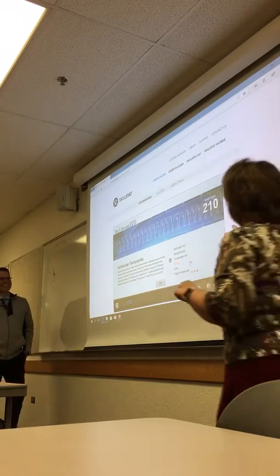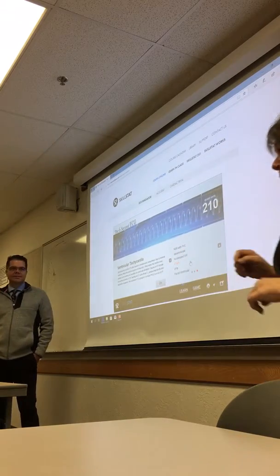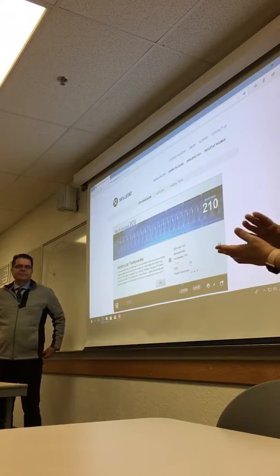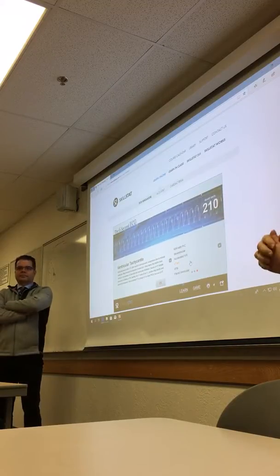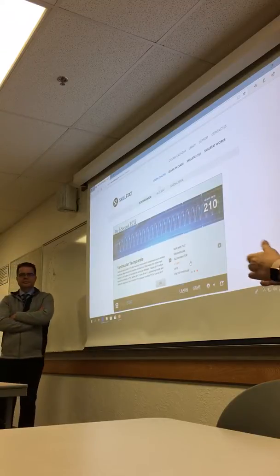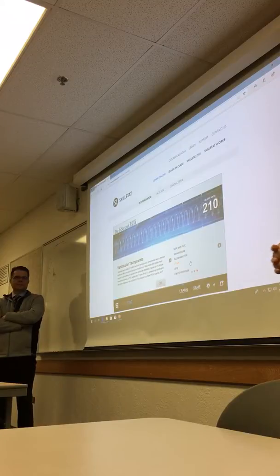So for people in this situation, the reason AEDs are saving so many lives is that the shock is what they need. And for these people that we used to do CPR on until the ambulance got there, now we can grab an AED, shock them earlier and save more lives because it's all about time. And that's why so many public places have AEDs.